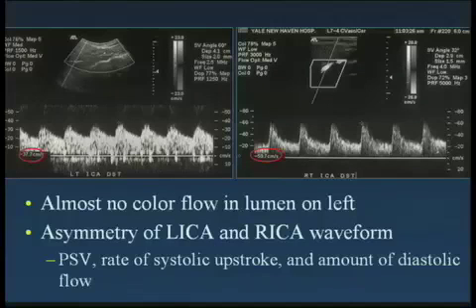Well, what you need to do is to compare the left side with the right side, and when you do that, you can see that although they didn't see any flow here, they just figured because it was portable that it was a poor exam.